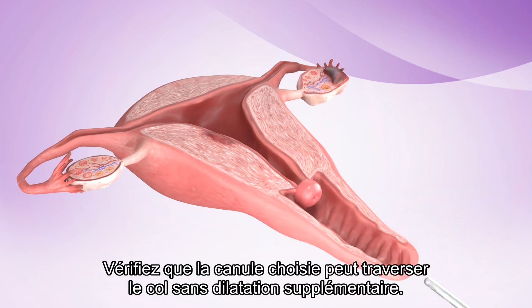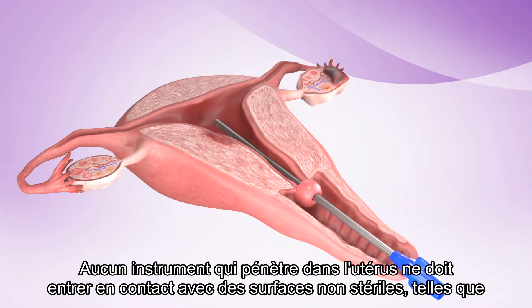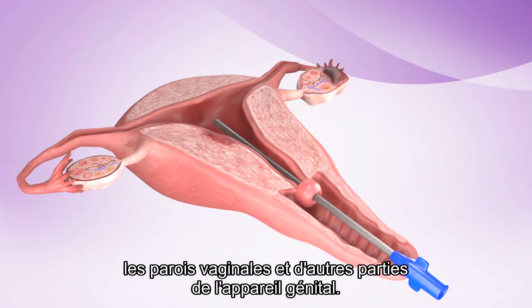Test to see if the chosen cannula passes through the os without additional dilation. A no-touch technique should be observed. Any instrument that enters the uterus should not touch non-sterile surfaces, including the vaginal walls and other parts of the reproductive tract.